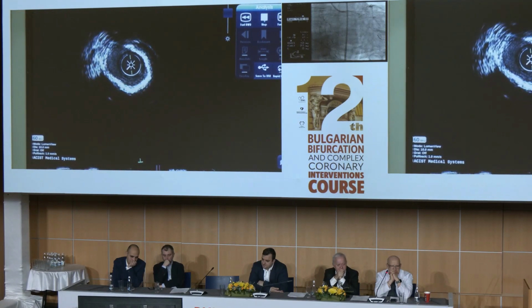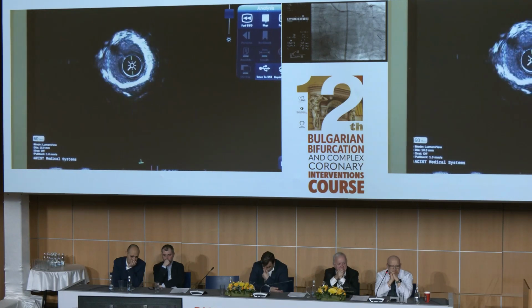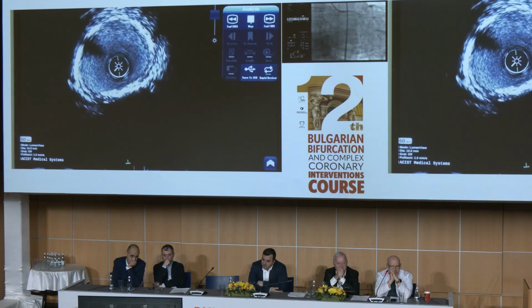This is LAD. This is LAD, here. And the minimal lumen area is 2.7.